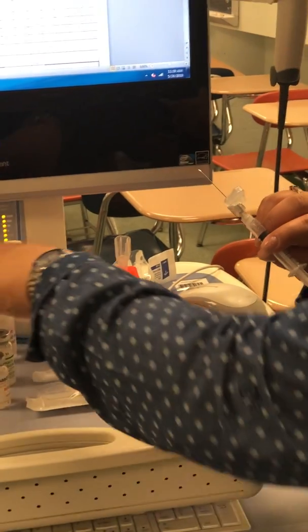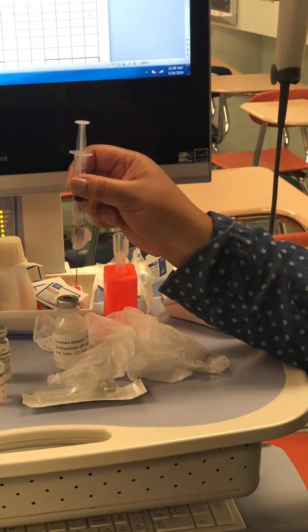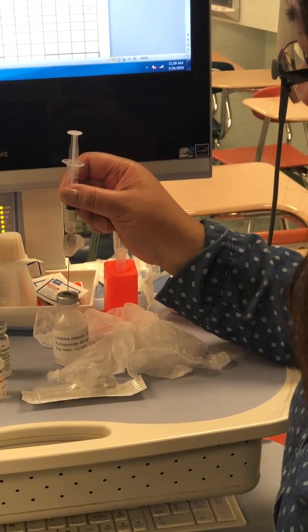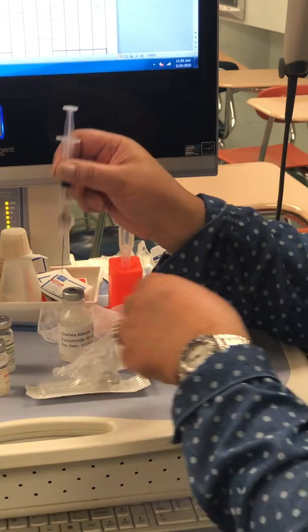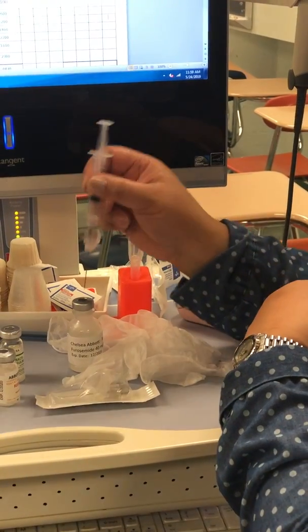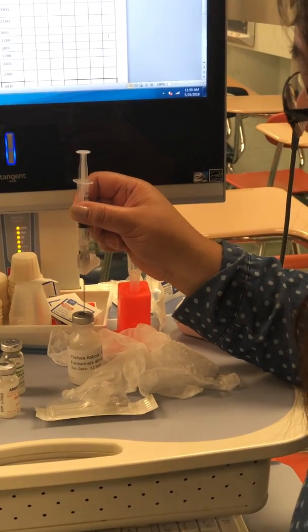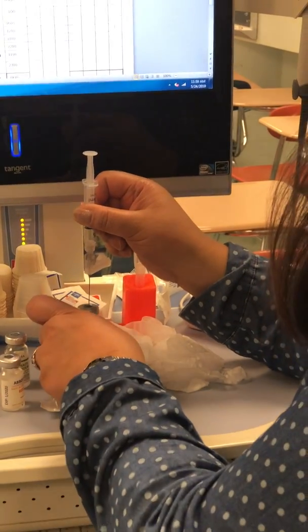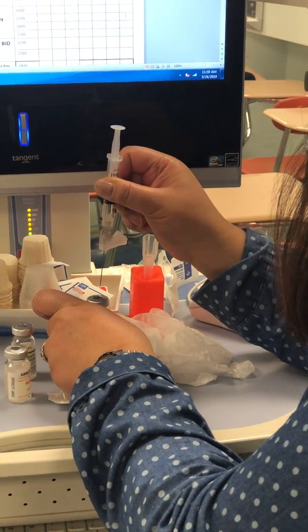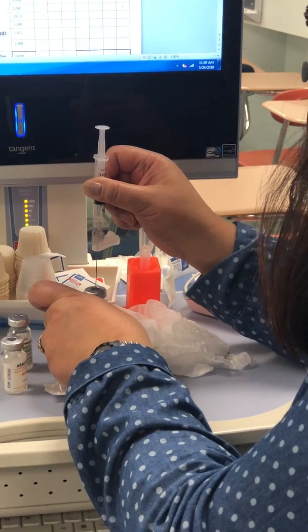And then we will go over here. So you don't need to hold the bottle because if you have your hands here and you're shaking during the performance exam, you might stab yourself, you know. So for safety, you put the needle in first. All right, so in the middle. Why is this right like this? It's so hard.